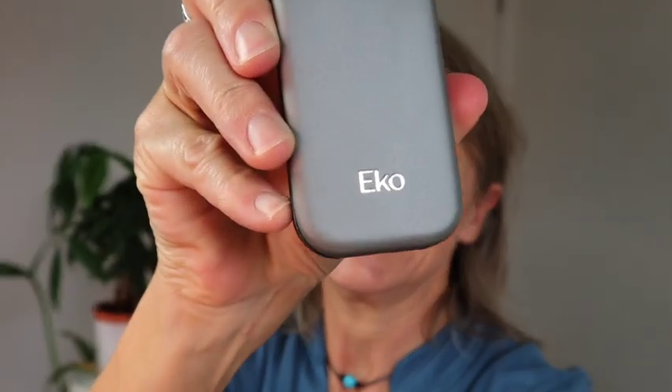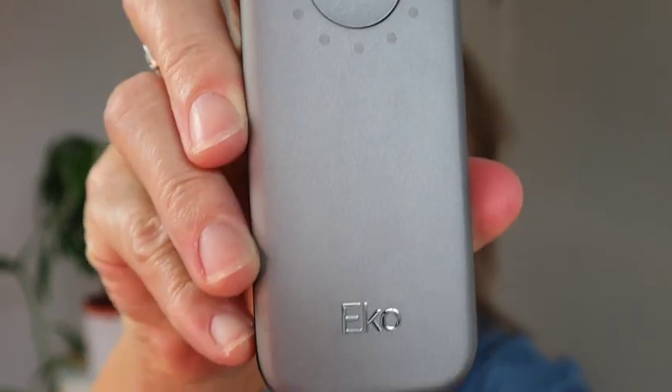Hey, it's Deedee from Healthy Hearing Loss. Today I'm going to be talking about a new device that I'm super excited and optimistic about. It is the Eko DUO ECG Digital Stethoscope. It's a nice little gadget. I'm going to share five different ways that you can connect to the Duo if you decide to buy it. You can do it with or without hearing aids, so stick around.